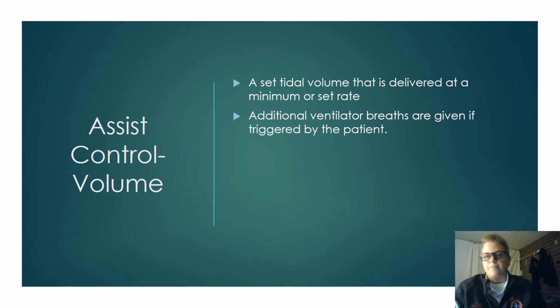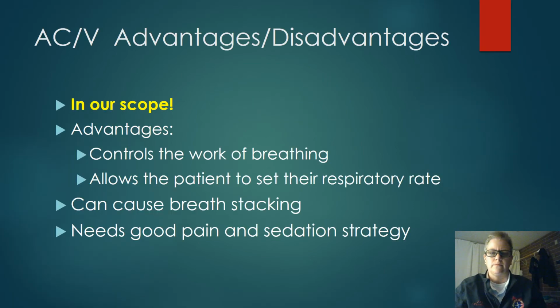So this assist control is great. It's something that we can use. This is what we can use. We cannot use SIMV. We're going to talk about that in a minute, but according to the EMS Physician Commission, we have to use assist control volume.